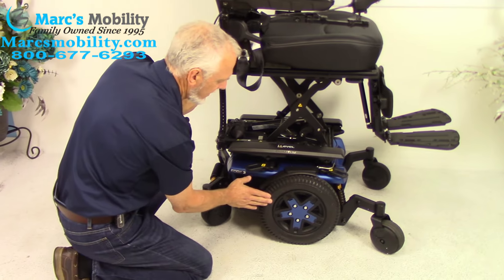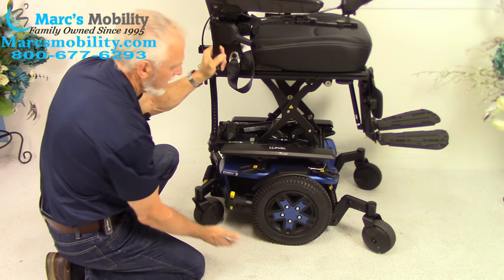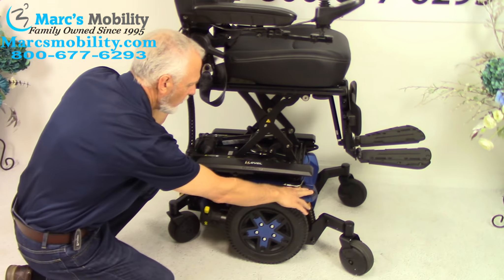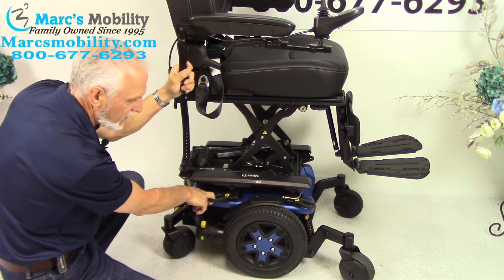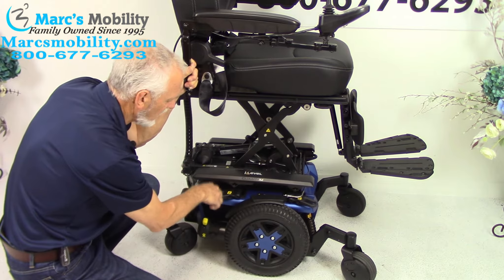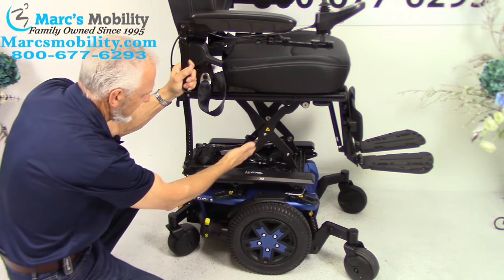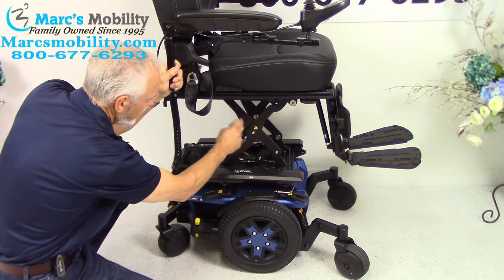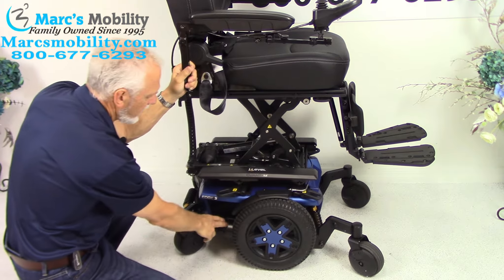We have 14-inch solid non-marking tires, with caster wheels in the front and back. Like all Quantum Edge 3s, you've got super anchor points — one here, one here, and two on each side, four altogether. This is where you secure your chair to a lift or van for transport. These anchor points are on the frame and they're not going anywhere. Right here you can see your actuators — this is the seat lift frame, which is a four-point frame, giving a lot of stability on both sides.